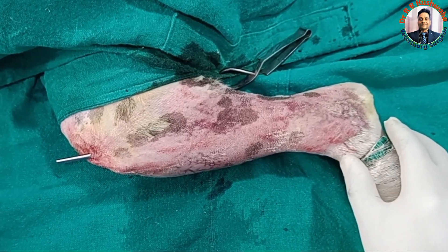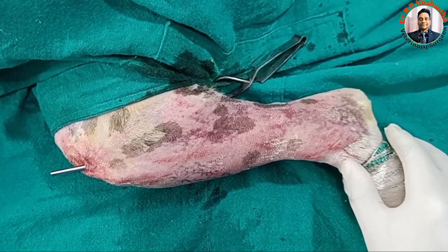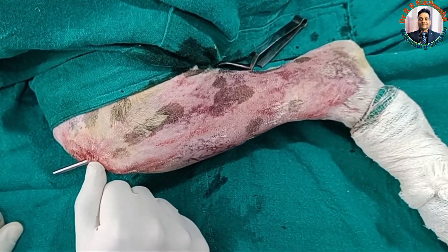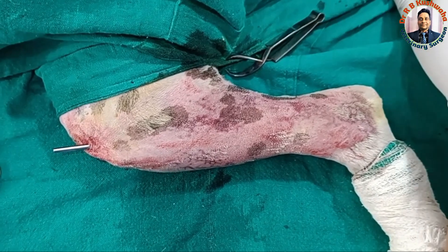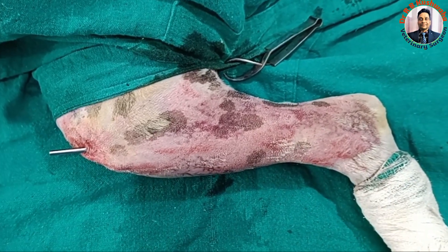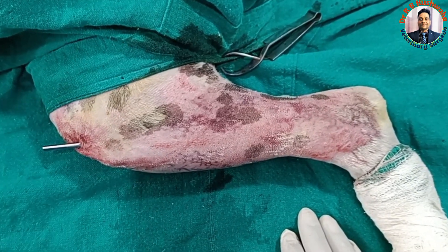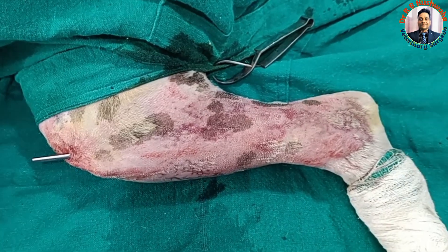We have taken the radiograph and it revealed that the pin has gone into the distal segment appropriately. We took both views — lateromedial as well as anteroposterior — and both confirmed the pin placement is correct. We cut the extra portion with a pin cutter and proceeded with robust bandaging. The advantage of this technique is that healing will definitely be faster compared to open reduction. Normograde pinning is always used in the tibia; retrograde pinning can be performed in the femur and humerus.